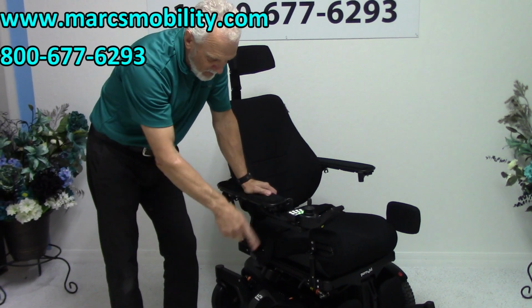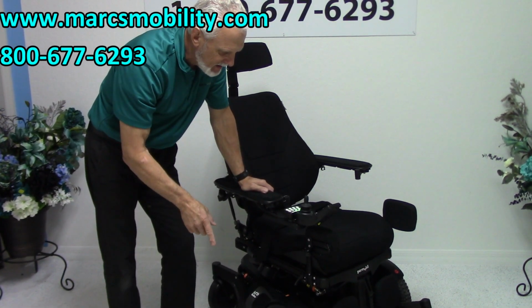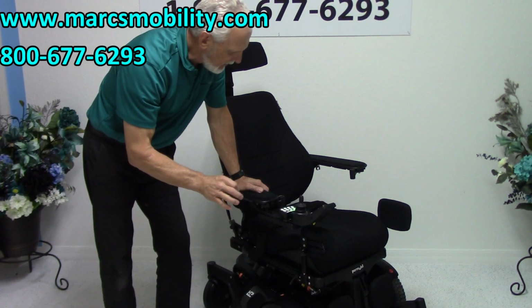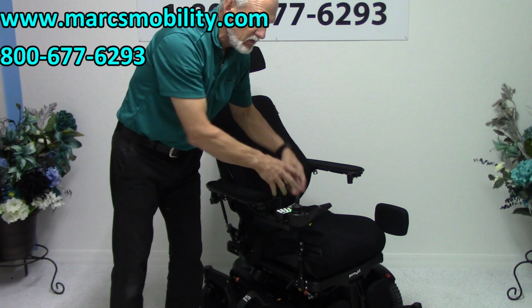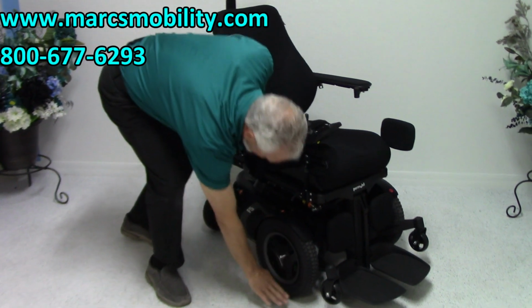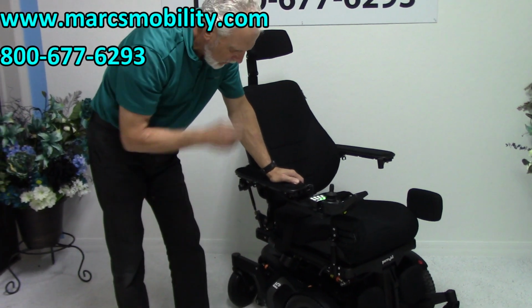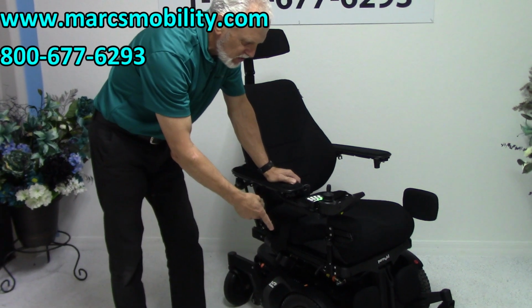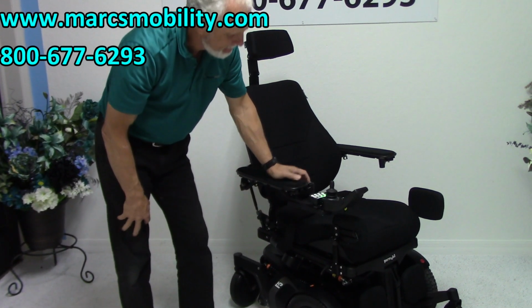And by the way, this is a front-wheel drive power chair. Great for outside, very good for inside, but outside it's very good because the chair weighs 400 plus pounds, and if you have a 200 pound person, that's 600 pounds of weight transferred right over here on your wheel, so you have good traction. So if you're in the grass or where it's slippery, you'll have a better chance with a chair like this, front wheel drive, okay?